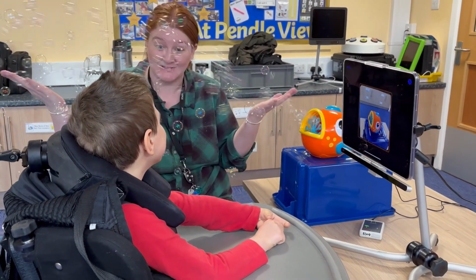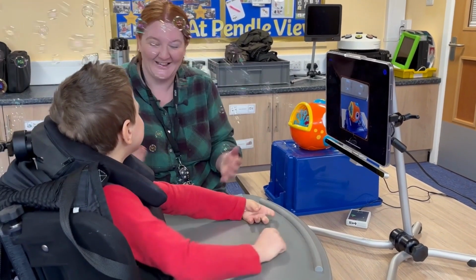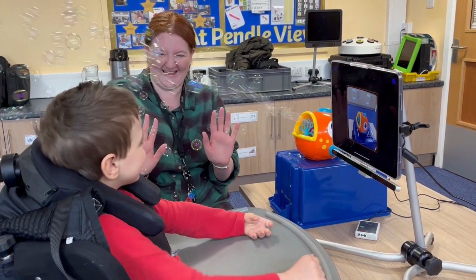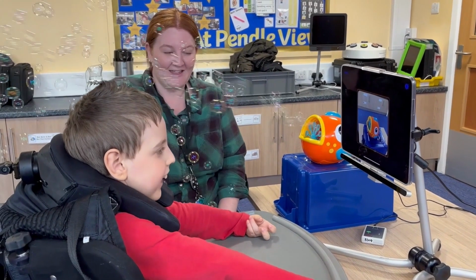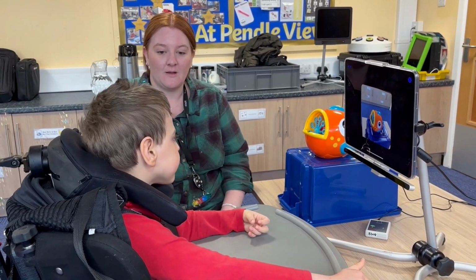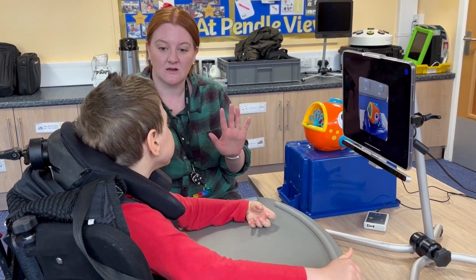Raining bubbles, on and off. Can you make them stop? Yeah, how do you make the bubbles stop? Good boy. So there you go. Bubbles have stopped. Looking at the picture on the screen, you can make the bubbles stop.